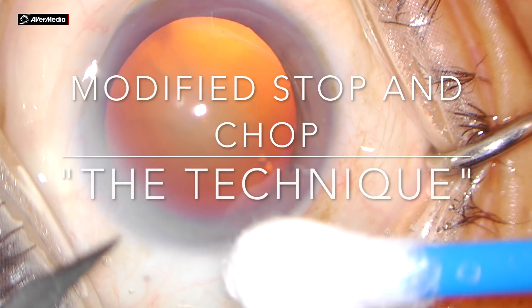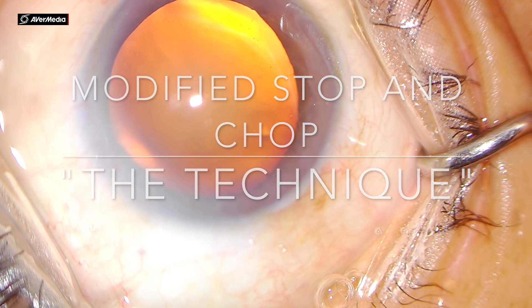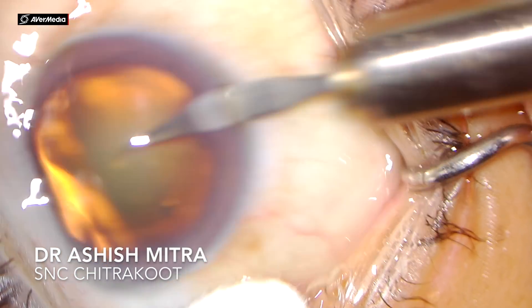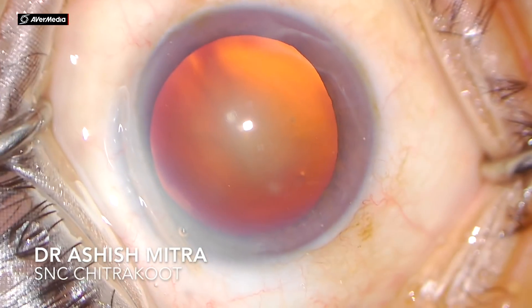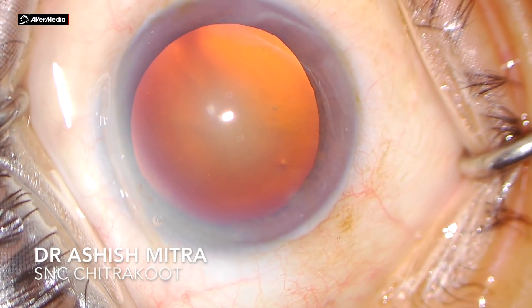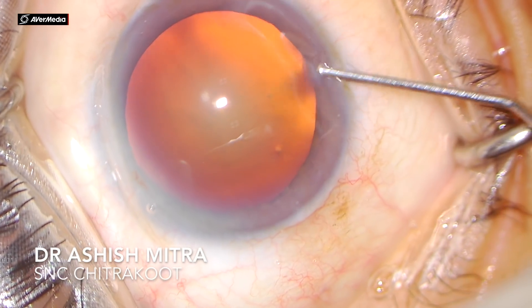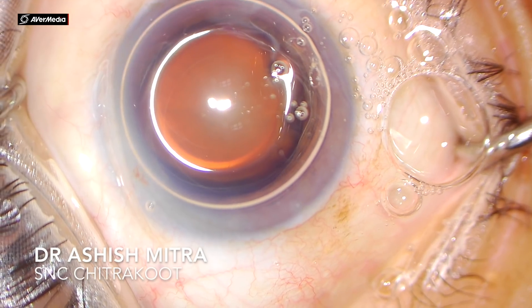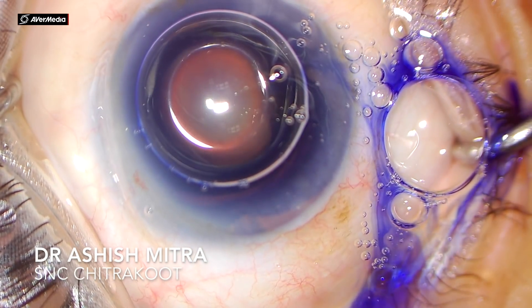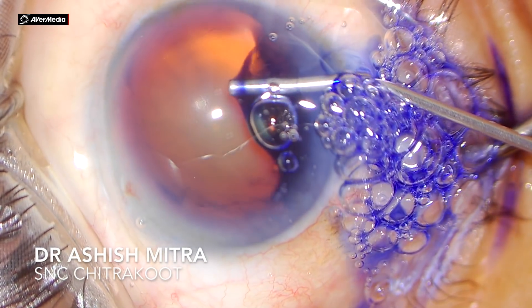Hello everyone, today I'll be talking about modified stop and chop, especially for beginners. This is the technique I usually follow in all my cases, except for very soft cataracts where I just try and do feco aspiration if possible. But for all cataracts — be it grade 2, grade 3, or even a harder cataract — modified stop and chop is a better technique.